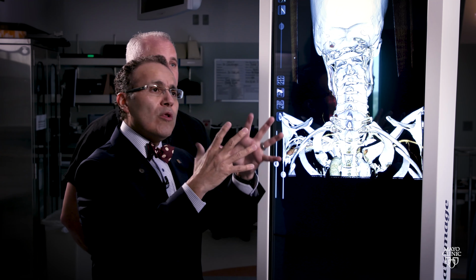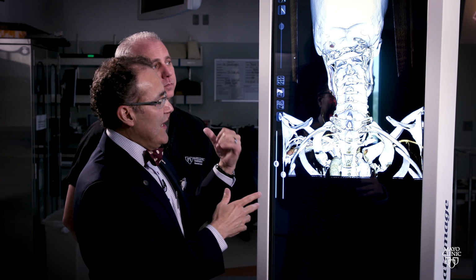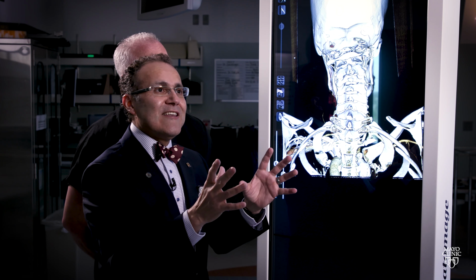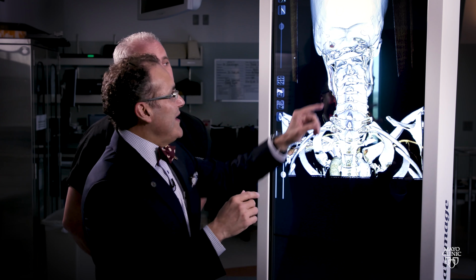And they all got put together in this special machine. And then thanks to the expertise of Conrad and his team, they reconstruct. They do a three-dimensional reconstruction. And then suddenly you begin to make sense of what is going on. And it became very apparent that what we had, which is nothing else but a blood vessel that is very thin, suddenly the bone just moves and completely blocks the flow of blood into your brain. And that's why the patient was having these amazing symptoms.